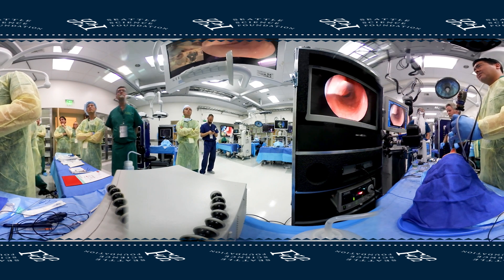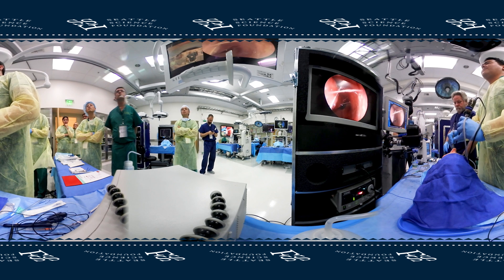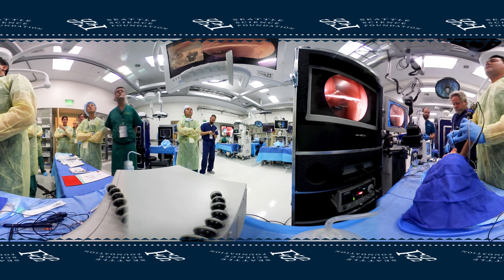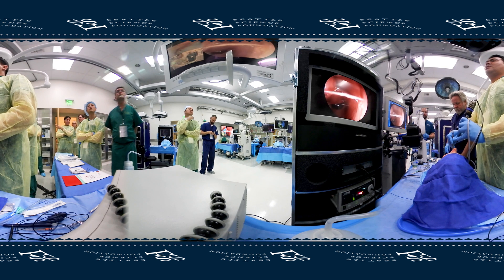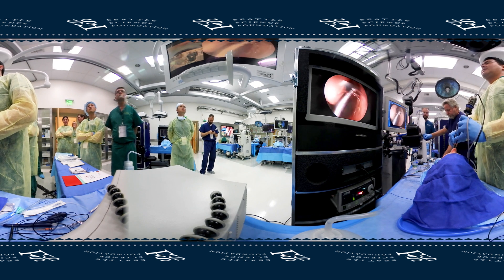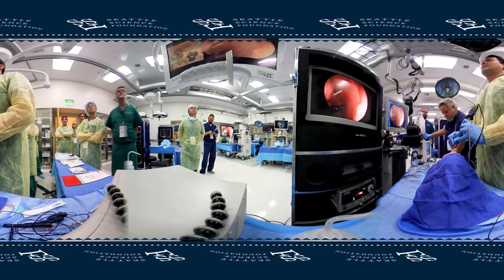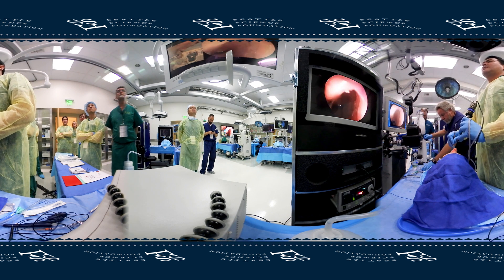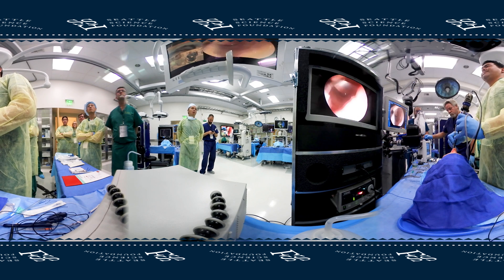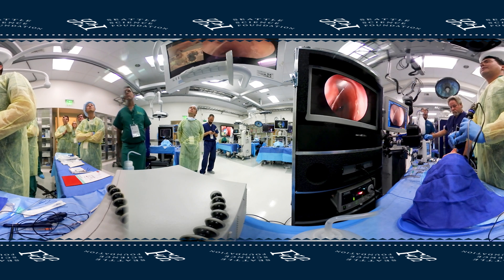We're just going to look for the valve of Hasner. You'll usually see it as a little flap of mucosa. If you identify that, then you know that if you stay below it and posterior to it, you're not going to violate the lacrimal duct. Greg's already exposed it for us up here, so we know it's going to be right in that area.